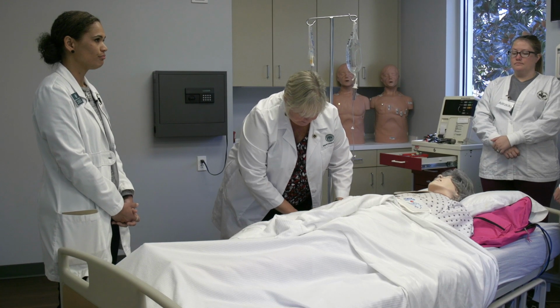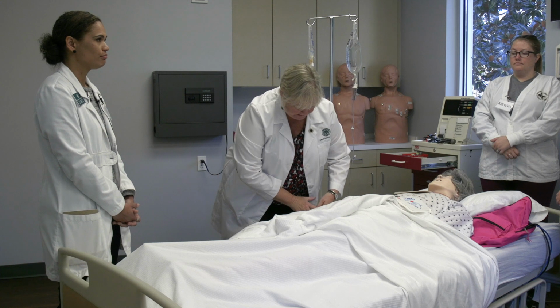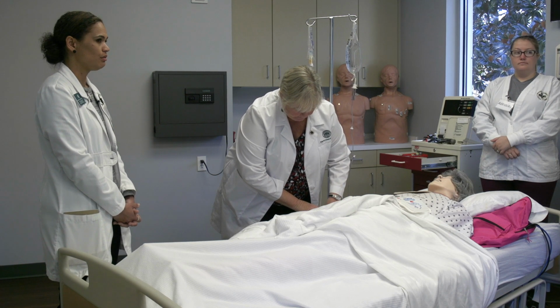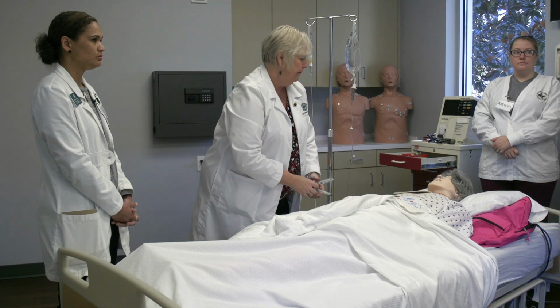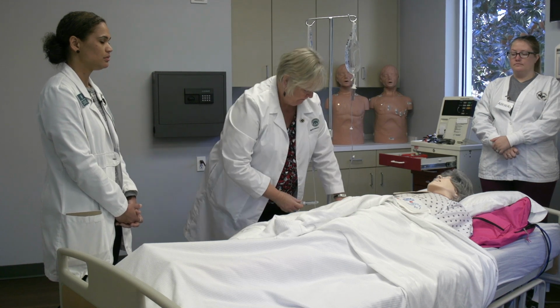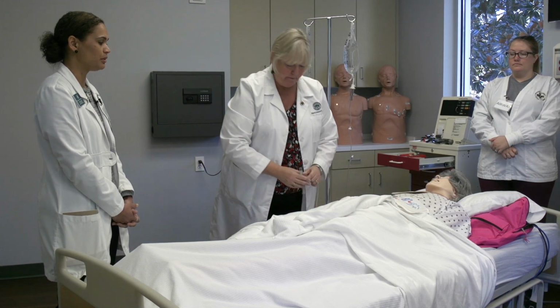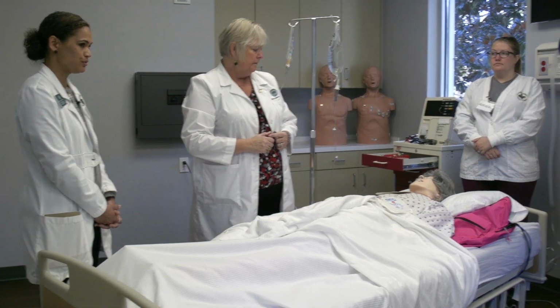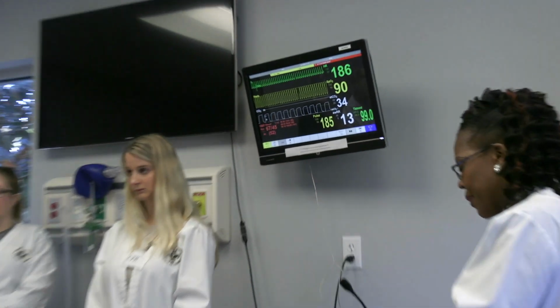Adenosine 6 milligrams in, followed by a 20 cc flush. There was a slight little pause, and then the rhythm continued on as it was after getting that adenosine. Okay, so there's been no change in the rhythm. Does the patient still have a pulse? She has a pulse, very weak pulse, yes.